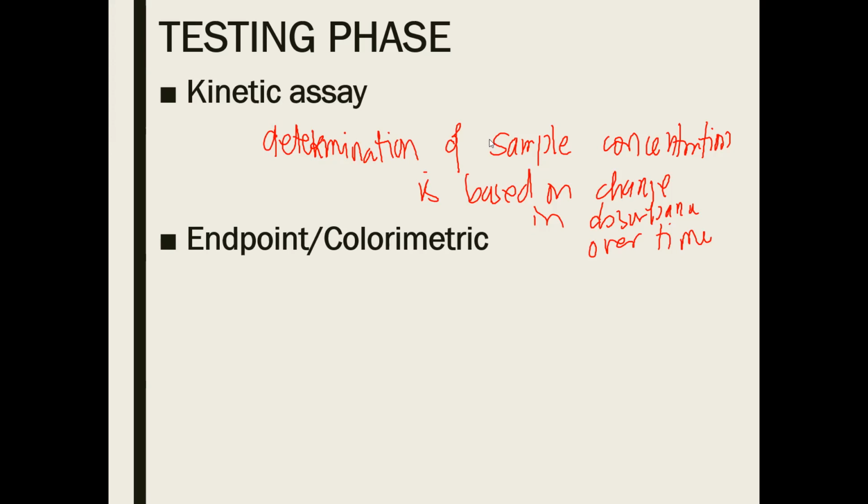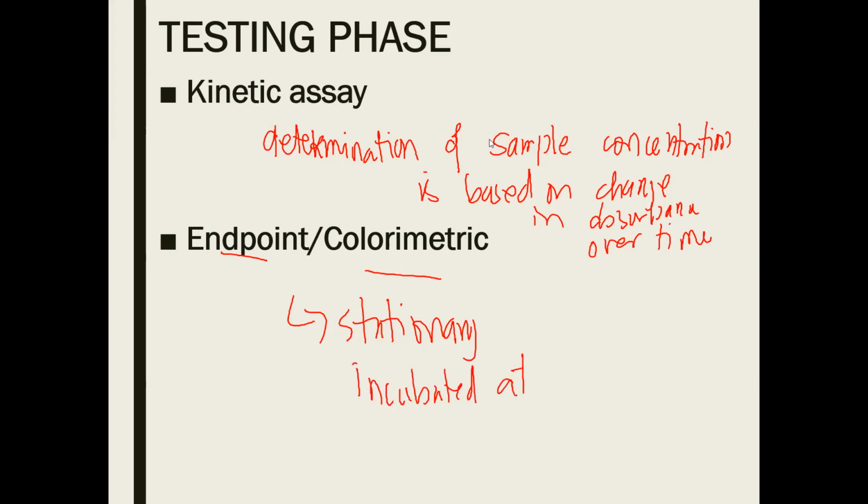Kinetic assay determination of sample concentration is based on the change in absorbance over time. Kapag po sinabi nating endpoint or colorimetric, stationary. Kapag sinabi nating endpoint or colorimetric, there is what we call incubation at a specific time or specified time, then absorbance is determined.